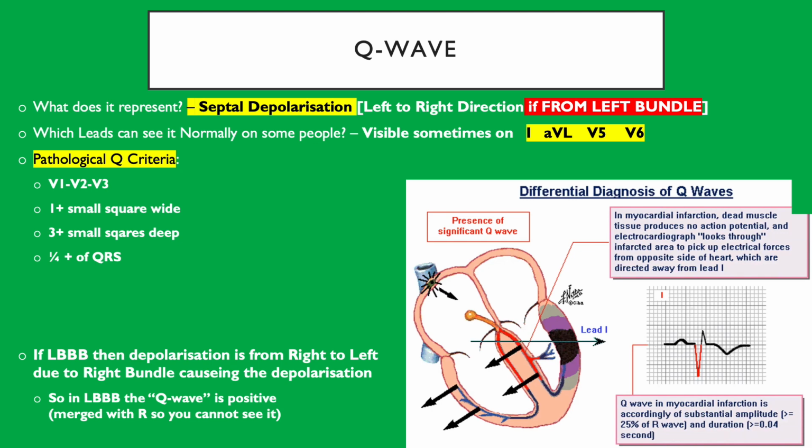You know that the leads, they like chaos, right? They are very happy and positive when they see depolarization coming towards them, and they're also happy when they see repolarization going away from them. Okay? They love chaos. That's how to remember the positivity. So here you have depolarization going away, so lead one is not happy. Okay? Because the depolarization that it likes, the chaos, is going away, so it's becoming sad. That's an easy way to memorize it.